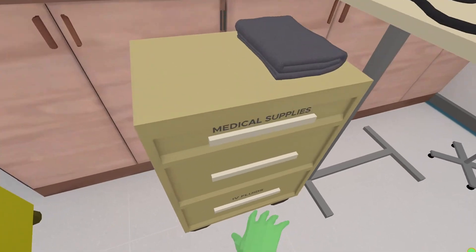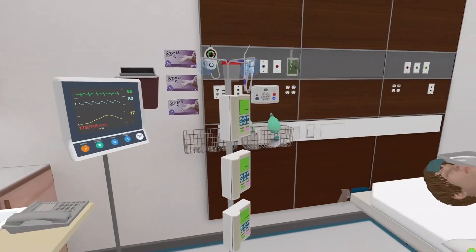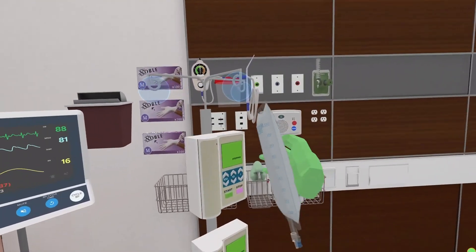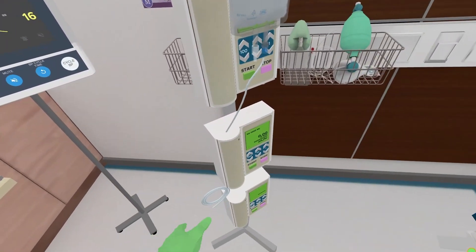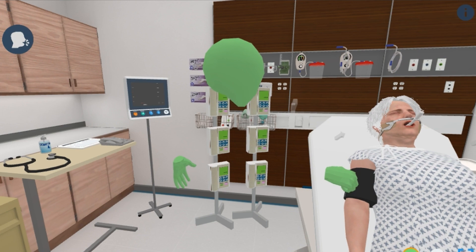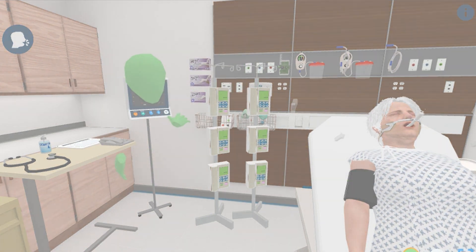The SimX Virtual Manikin Series gives educators the perfect all-in-one simulation tool, elevating the way medicine is practiced.